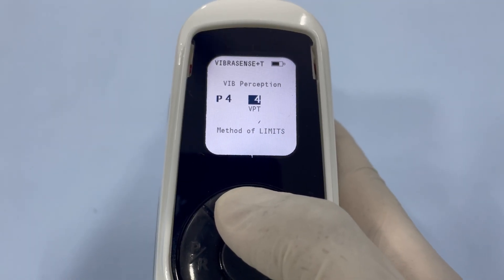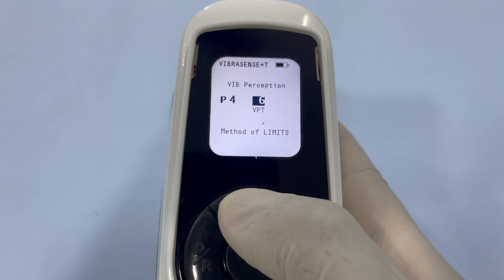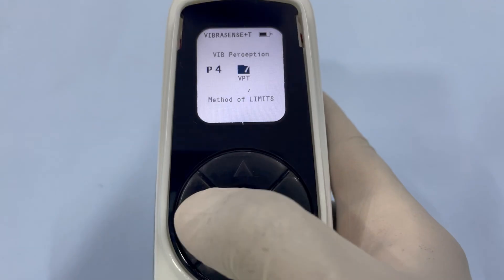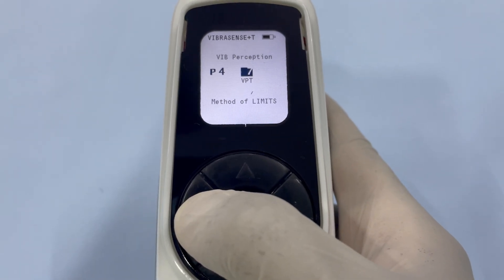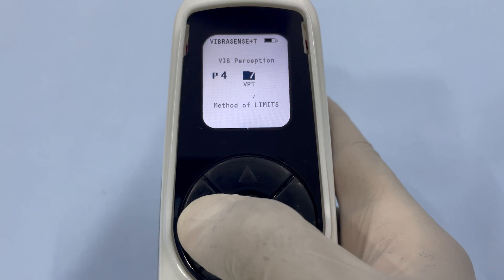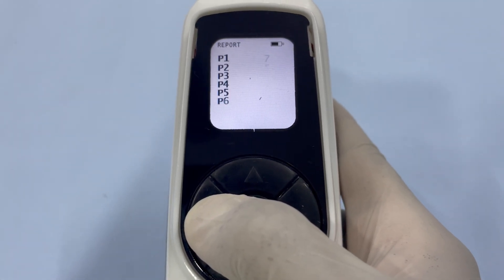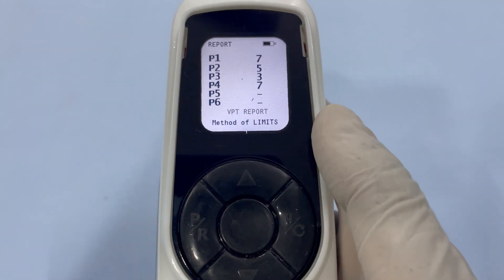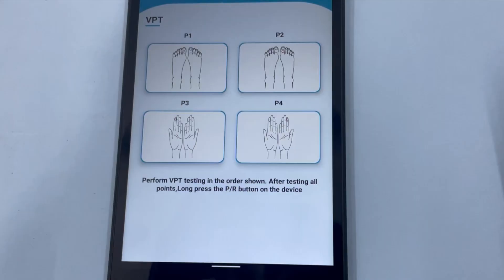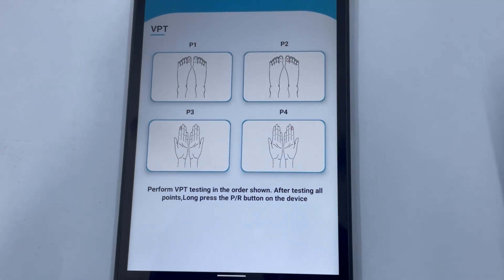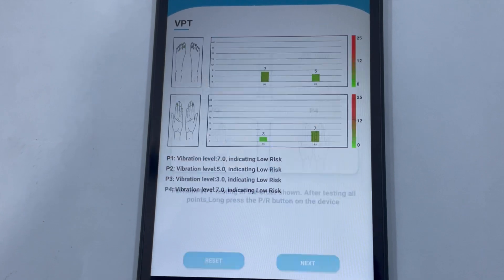Once all four points have been tested, you're ready to save the data. Bring the device close to your smartphone or tablet and long press the PR button.